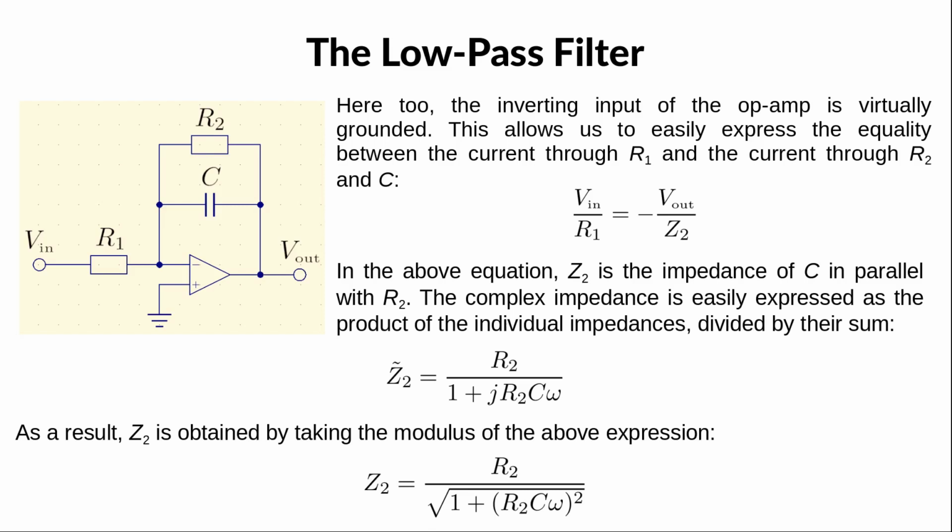In order to smooth out the output of the rectifier, we need to remove some high frequencies, so we use a low-pass filter. Taking advantage of the fact that the inverting input is virtually grounded, we can easily write the equality between the current through R1 and the current through R2 and C. If we call Z2 the parallel impedance of R2 and C, then we have Vin over R1 equals minus Vout over Z2. Here it is important for what follows to keep in mind that the output voltage is negative.